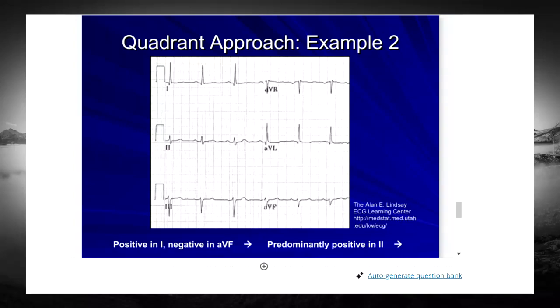For instance, in the clinic, I have an ECG machine that is this big, so it can't print out a full strip of paper like we've seen some of the ECGs print out. So what it does is print them out straight in a line: lead 1, lead 2, lead 3, AVL, AVR, AVF, V1, V3, V6, straight in a line. I still need to be able to say lead 1 is the one I'm looking at, AVF is the one I'm looking at. But if you have a standard paper, then you'll have it like this.